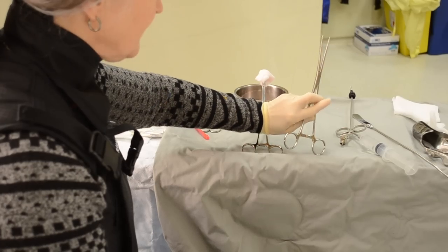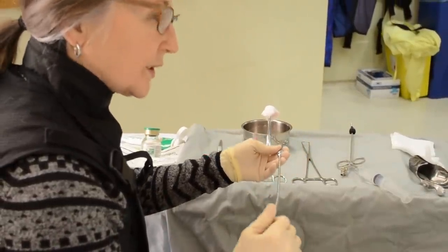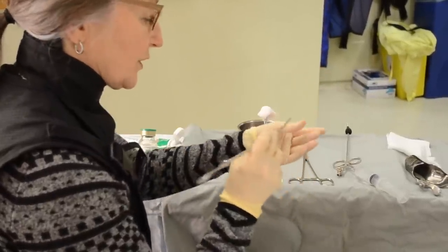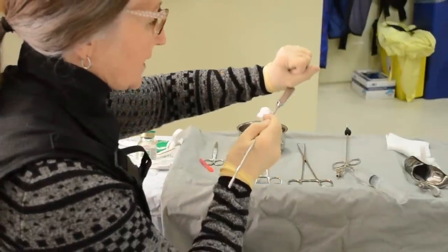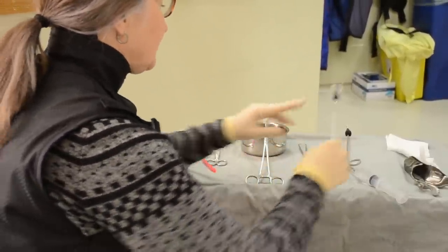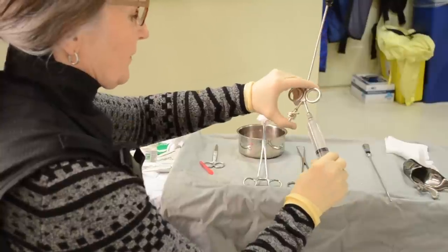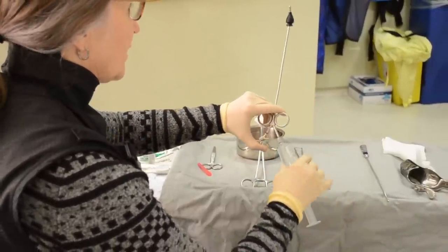Single-tooth tenaculum. The sound — I don't think I've ever actually needed to use this to put the cannula in place. You don't really need a very big opening in the cervix to push dye in, so I don't think it's ever important to sound the uterus. But this is really helpful if the cervix is pointing downwards and I need to lift it up to allow me to see the anterior lip and put the tenaculum on at the twelve o'clock position. This cannula happens to have a second sidearm, which we need to block and occlude manually as well as using the stopcock, because sometimes the stopcock fails.